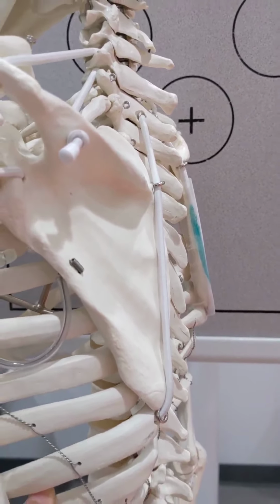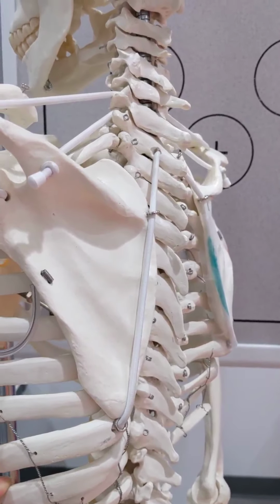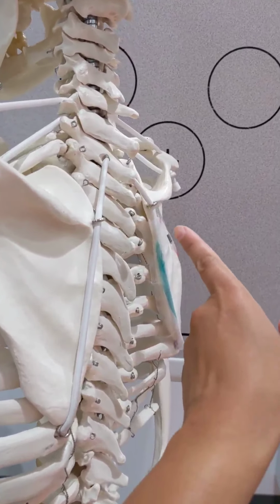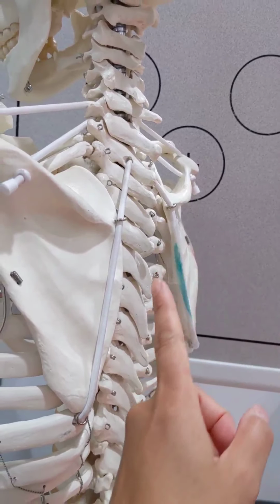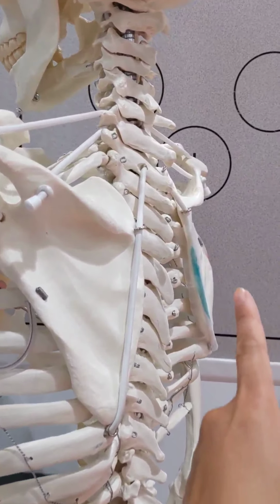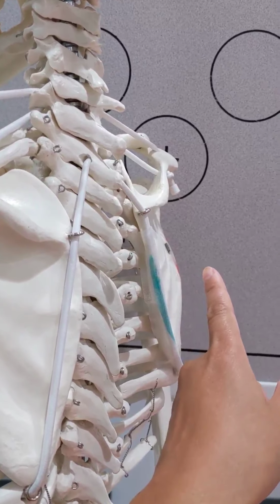So if we under-rotate the patient, so the patient's a little bit too close to PA, like this, so I'm flattening him out this way towards the board, you can start to see a little bit of red poking out. That's the lateral border of the scapula, and you can still see the medial border here. What happens with this under rotation is that the medial border now is seen closer to the ribs than the lateral border.